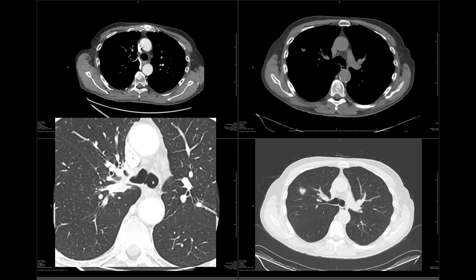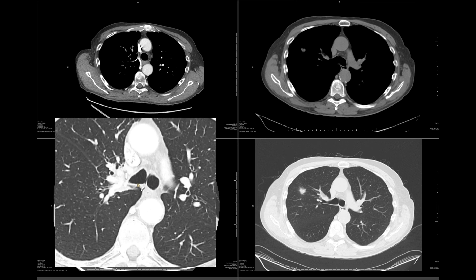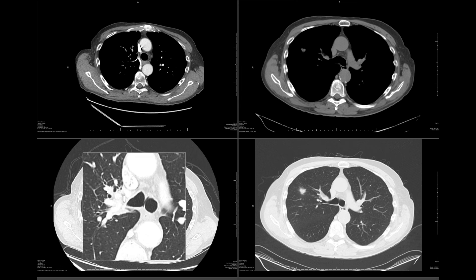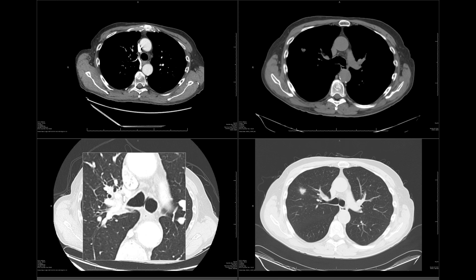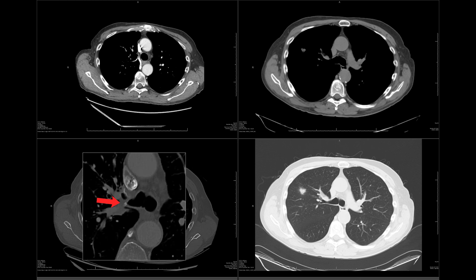Remember that the right upper lobe bronchus is the first bronchus arising from the right main bronchus. But in this case, as we scroll, all we have is this stump, which comes to a point. And if we go to the bone windows, you can see that there's a staple line right at the tip of that stump, which is where the right upper lobe should be.